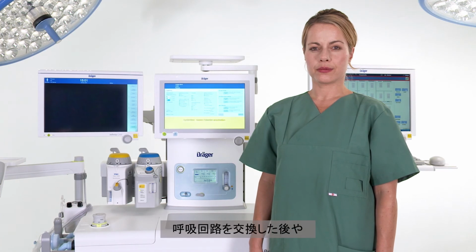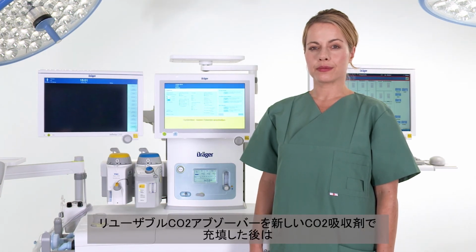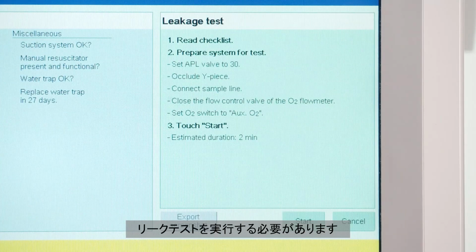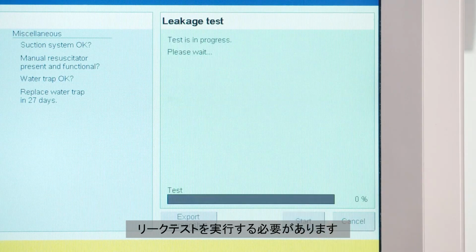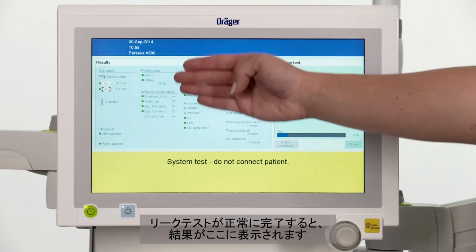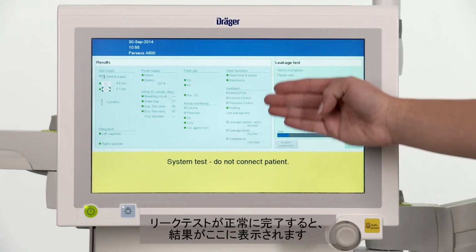After replacing the breathing circuit or filling the reusable CO2 absorber with fresh CO2 absorbent, you should run a leakage test. This test takes about 2 minutes. After successful completion of the leakage test, the results are displayed here.